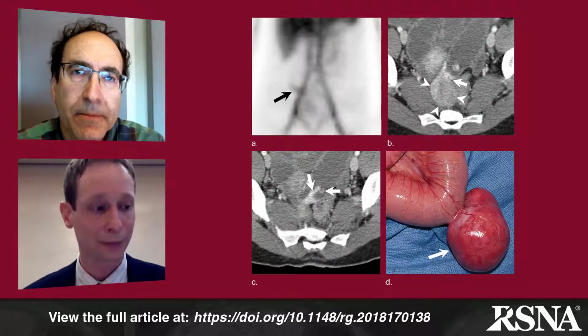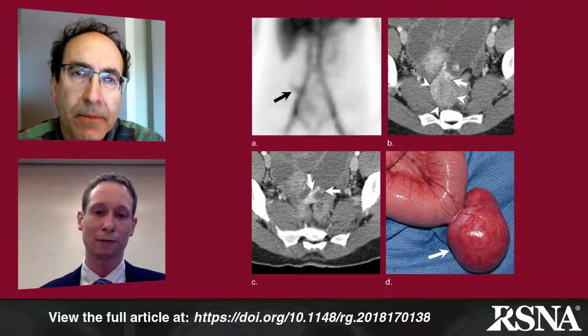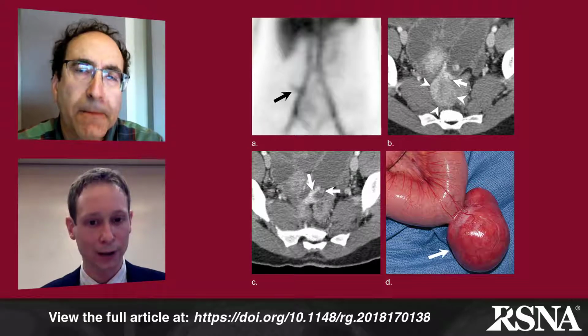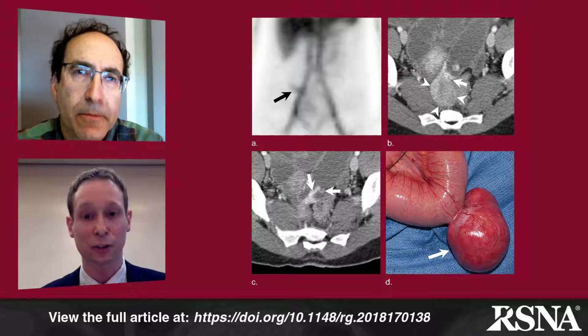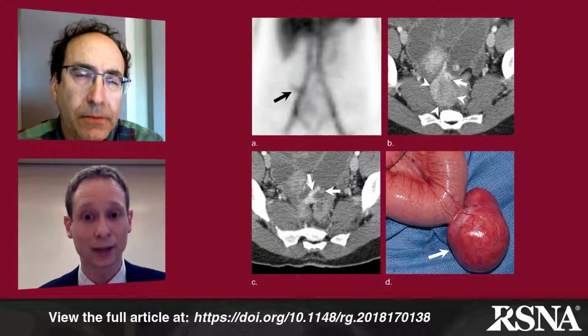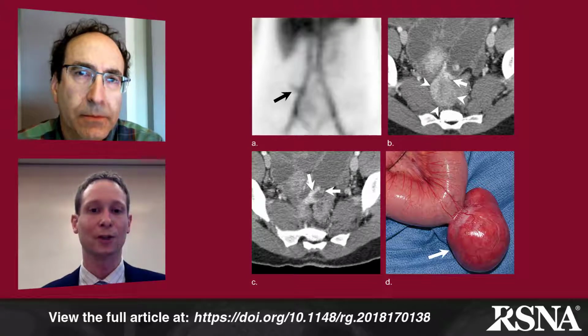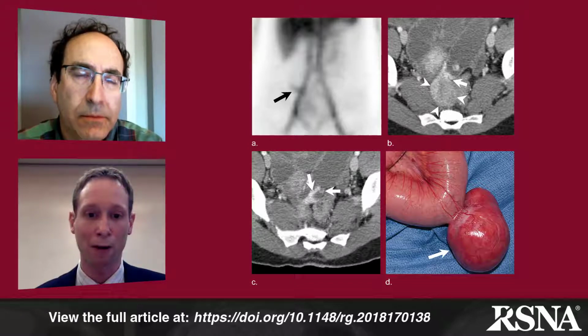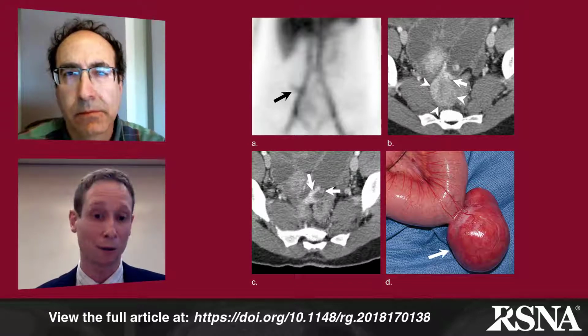Yep, absolutely. So patients who are presenting with bleeding and have had a negative upper and lower endoscopy are then said to have suspected small bowel bleeding. And for the vast majority of those patients, we would like to get multi-phase CT enterography to get an optimal evaluation of their small bowel and look for any pathology along the bowel wall.